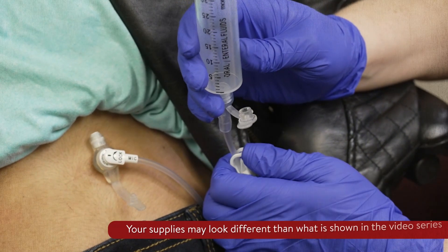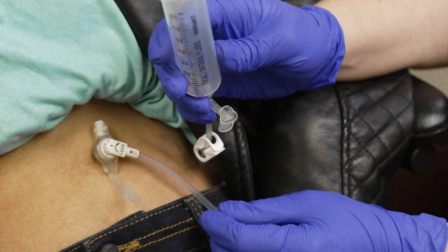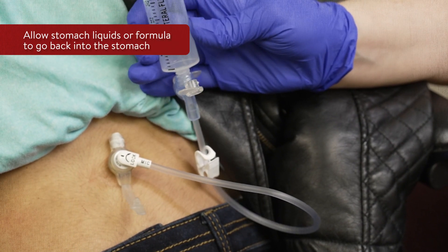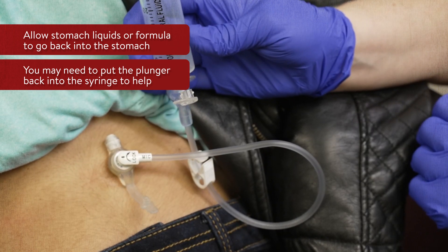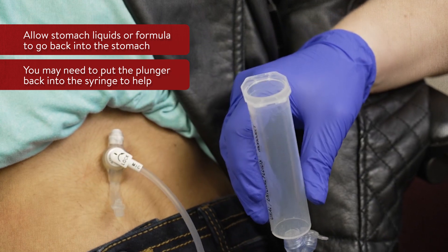Unclamp the extension tubing and allow air to escape. Once the air in the stomach comes out, allow any stomach liquids or formula to go back into the stomach. You may need to put the plunger back into the syringe and gently push down to help the stomach liquids or formula go back into the tube. Be careful not to push any air into the stomach.